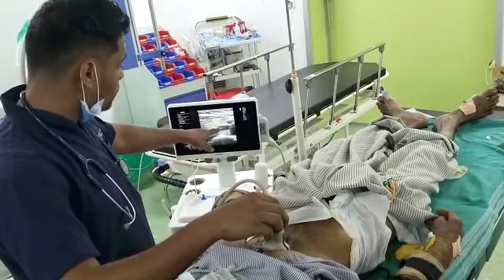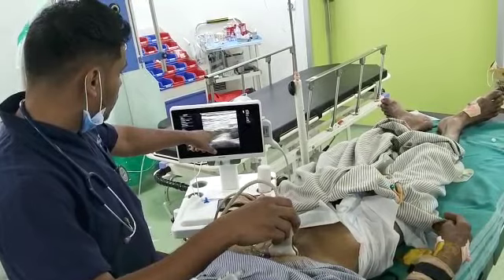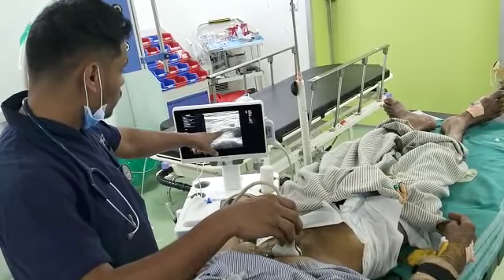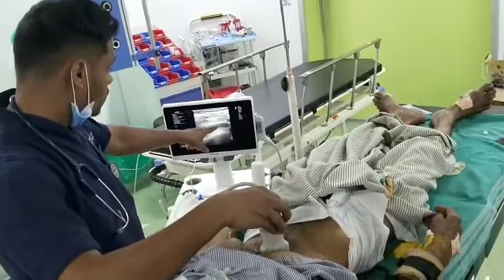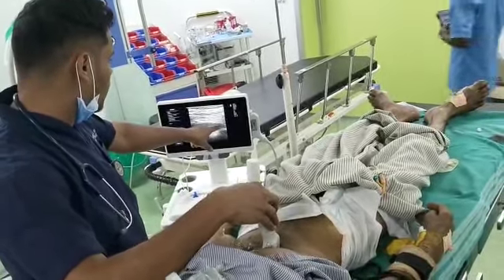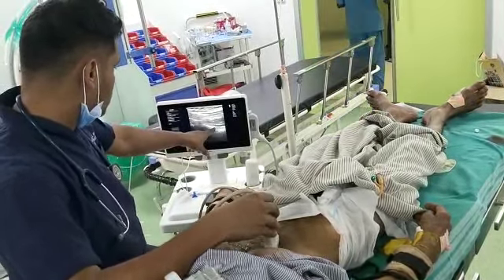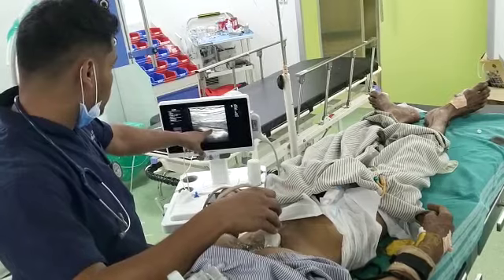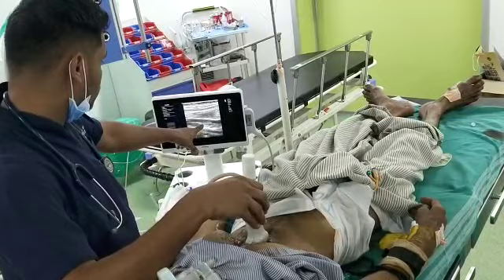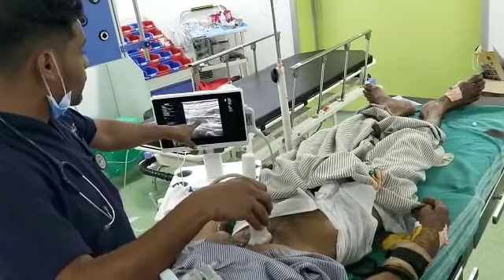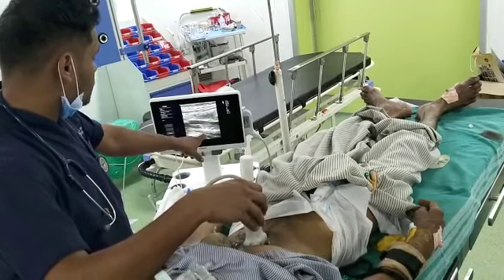Now I am going to rotate the probe vertically. This is the IVC. The IVC is easily compressible, and below the IVC there is the aorta.